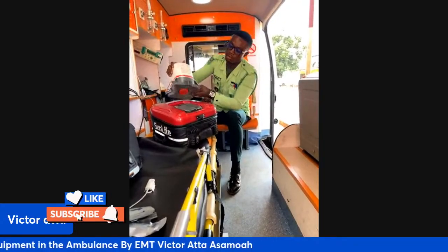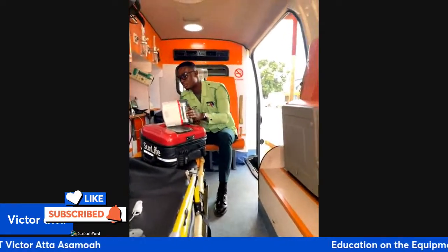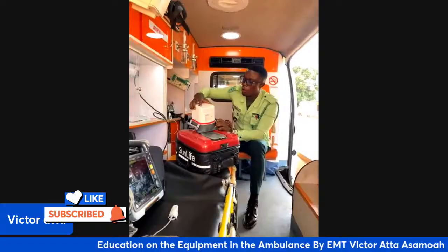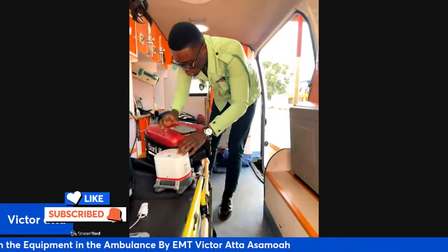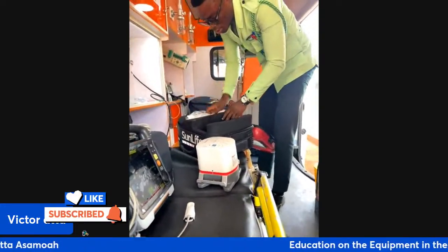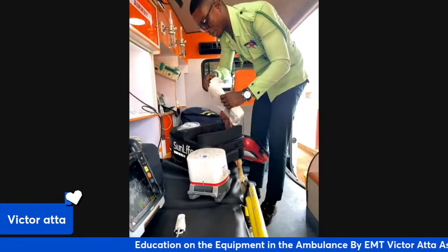It's an automatic chest compressor. We have 8 straps.